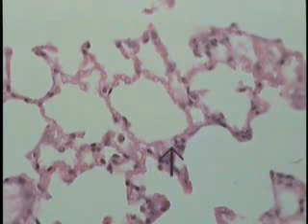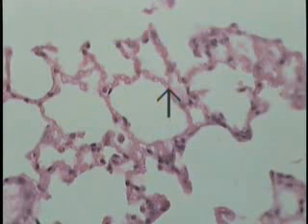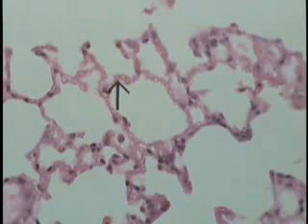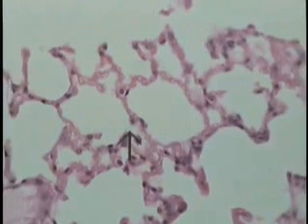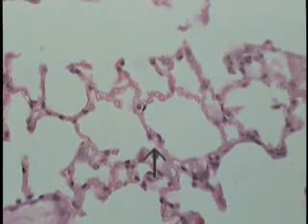Actually, what makes their walls easy to visualize is not so much the lining epithelium within their walls, but the erythrocytes within the capillaries. These small ghost-like structures forming the background and giving some sort of contrast so these alveolar walls can be visualized are erythrocytes within the capillaries inside of the alveolar wall, which is extraordinarily thin.